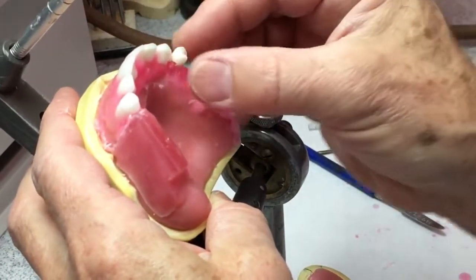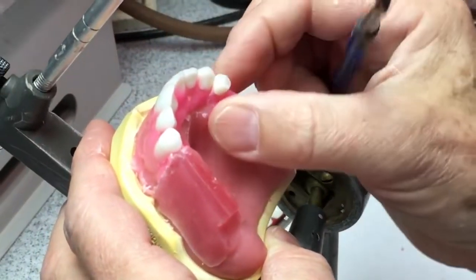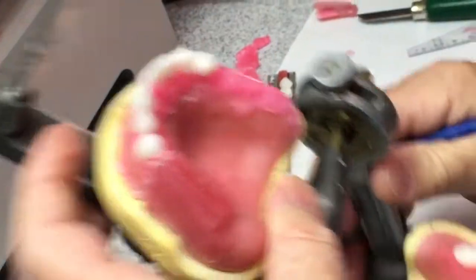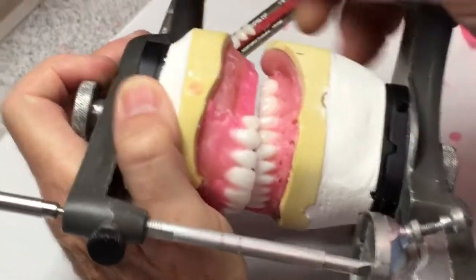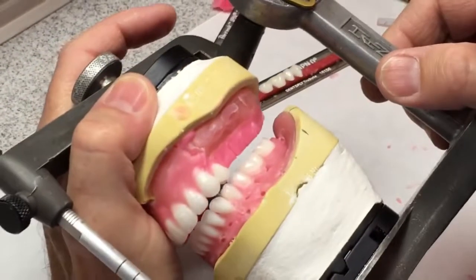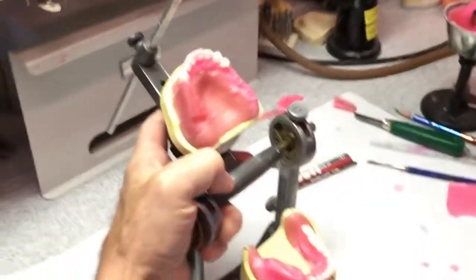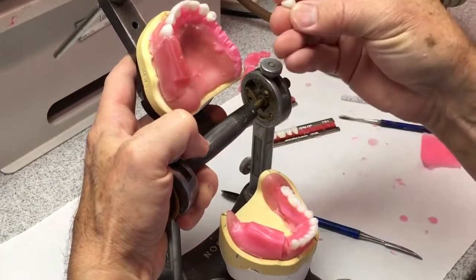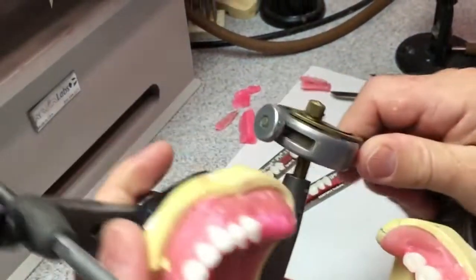When you set the first premolar, the tendency is to set it too buccal. Remember that you're lining up the cusp ridge of the canine with the cusp ridge of the premolar — the proximal contact is not way out there; it's in here. Set it up so the long axis is straight up and down in order to be in a flat plane. The buccal cusp should be no lower than the lingual cusp — if anything, it's going to be a little above the lingual cusp. That's what lingualized occlusion is, so there's no interference of the buccal cusp in excursive movements.